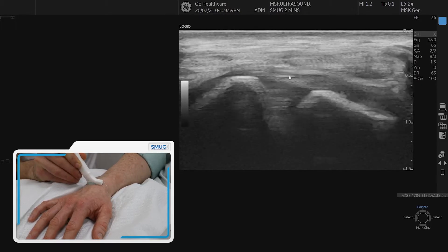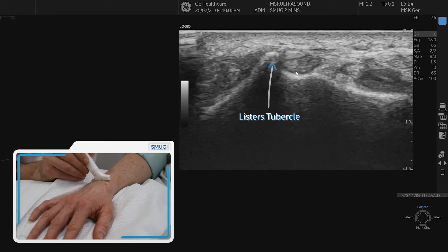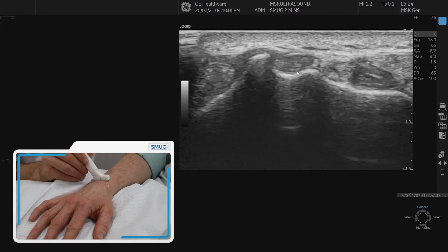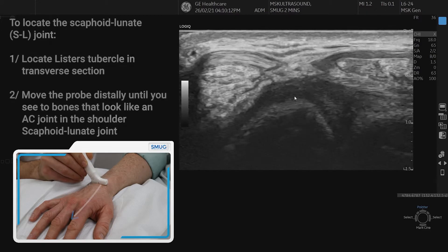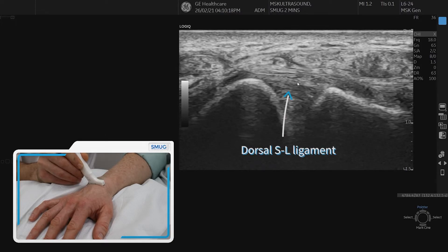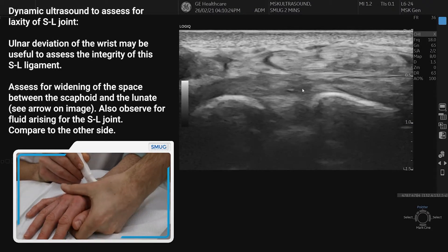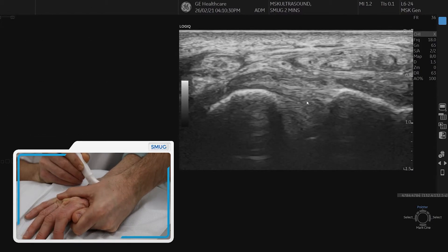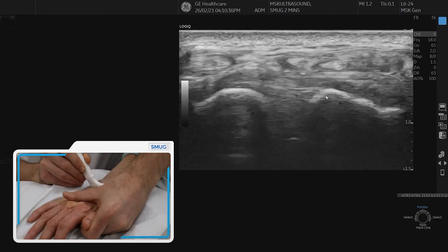Going back to Lister's tubercle, the first thing to do is assess the scaphoid lunate ligament. We can see the nice dorsal scaphoid lunate ligament if we slide more distally off Lister's tubercle. Look for any fluid, any thickening of the capsule. We also do a dynamic test — moving the patient's hand into ulnar deviation — and as long as those bones don't open up, we can say that's a stable scaphoid lunate joint.